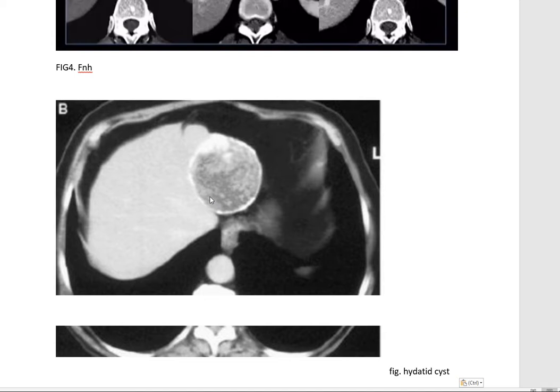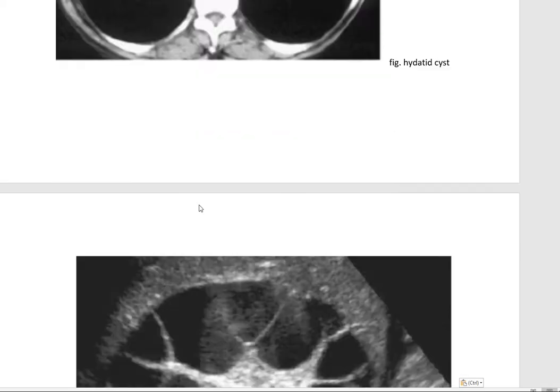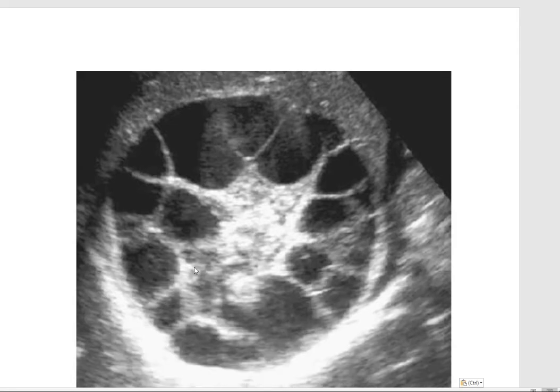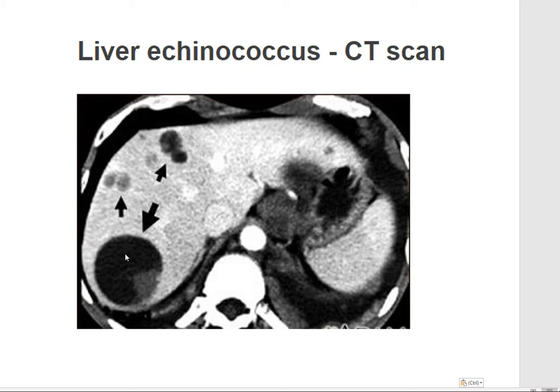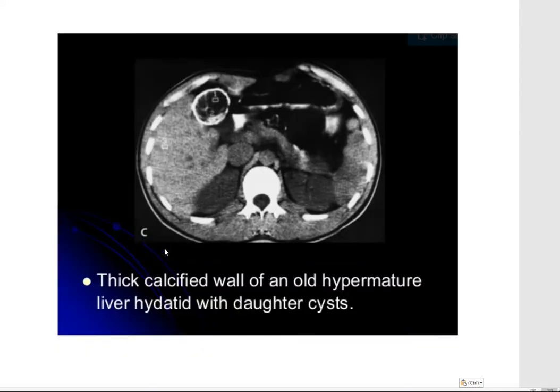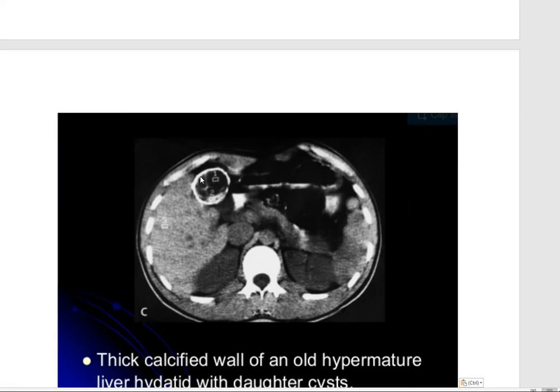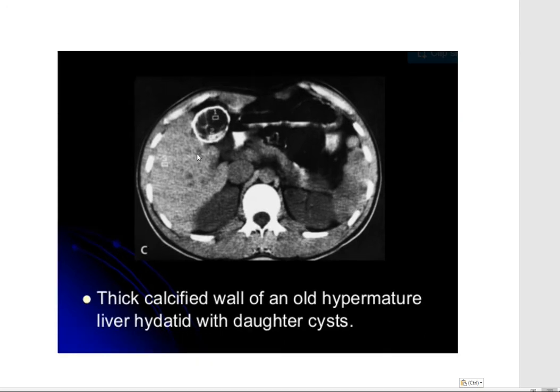Here you can see a hydatid cyst — it is calcified, with fluid and peripheral calcification. Here septations are not clear, but in this image the septations are clear with multiple daughter cysts visible. There are also multiple lesions — these are cysts with fluid, which appears black. You can see a thick calcified wall, and this is a hyper-mature liver hydatid with daughter cysts — one, two, three, four daughter cysts.